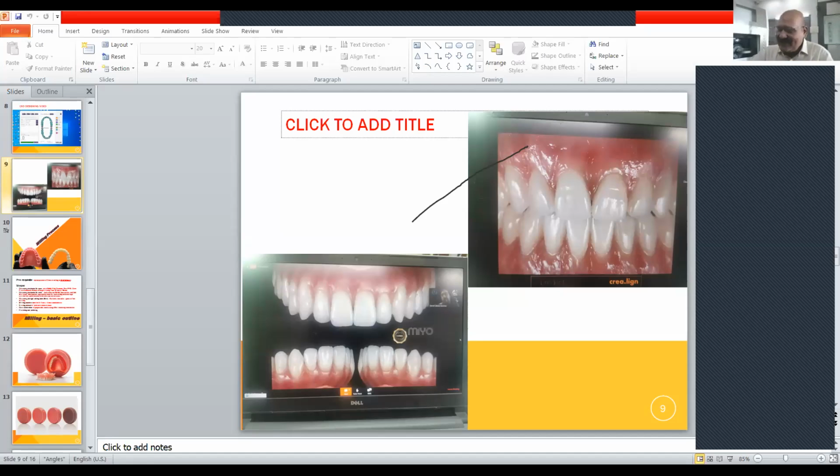But why would you need to reline? Let's say a year after, the patient comes and the denture is loose, and we think that everything else is all right and just a simple relining would do. Since PEEK is a nylon based material, can it be relined? Because I have not read in the literature that it can be relined.